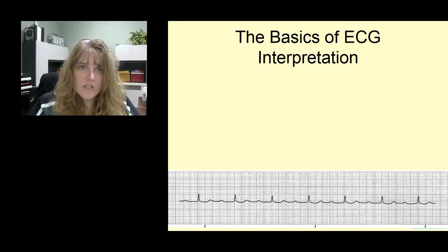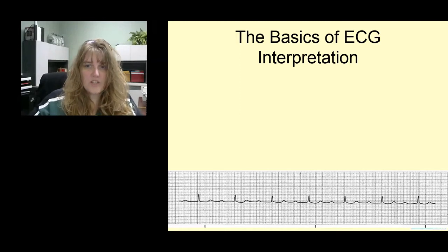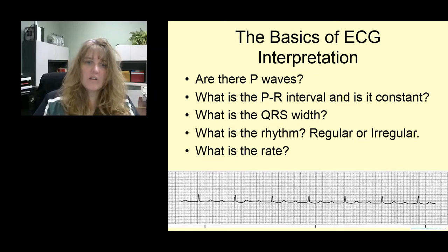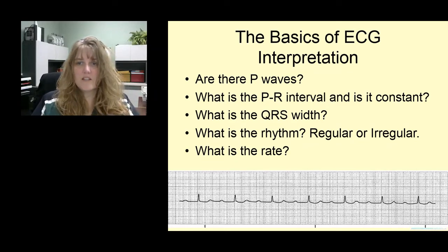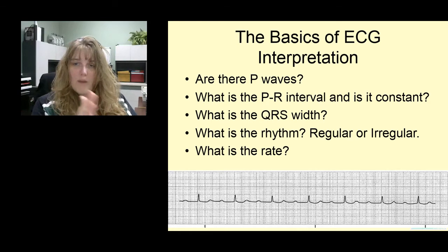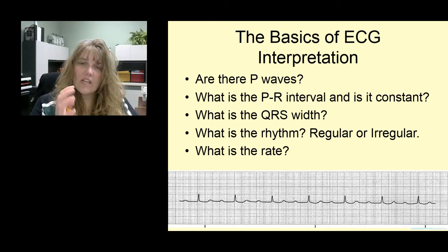And we are going to take just a slide or two to review the basics of EKG interpretation. With EKG interpretation, we want to ask a few questions. I always start with, what is the rate? Because it's the easiest thing that I can teach students to start out with. So what is the rate, and then what is the rhythm? Does the ball bounce regularly across, or is there some irregularity in it? And then we start looking at the specifics.